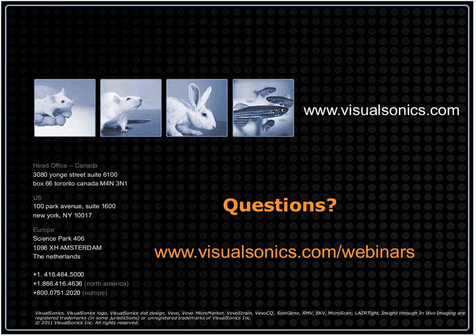Okay, Steve, thanks. That's great. Another question about short cine loop lengths. You mentioned that if the cine loop is less than 20 seconds, the software prompts you. The question here from one of the hosts today is, why do you recommend 20 seconds, and what might happen if it is shorter?